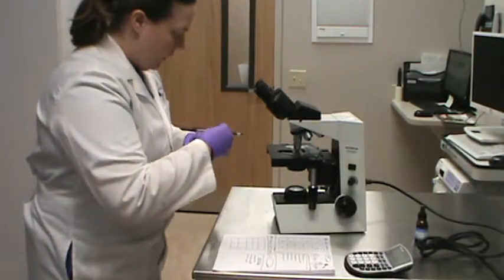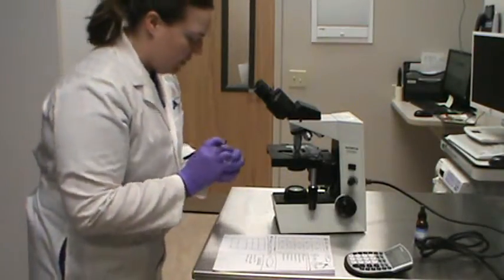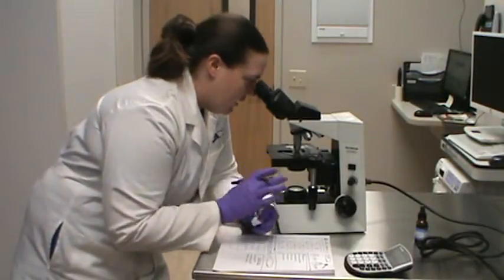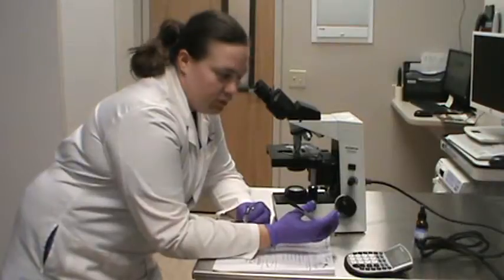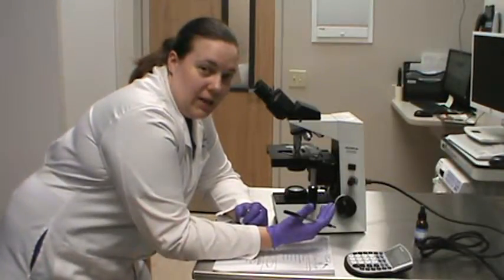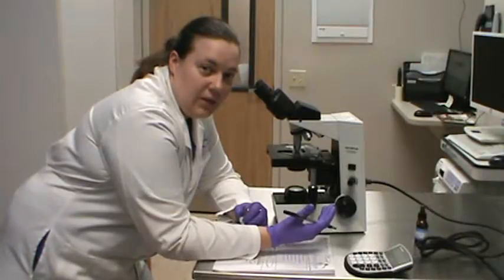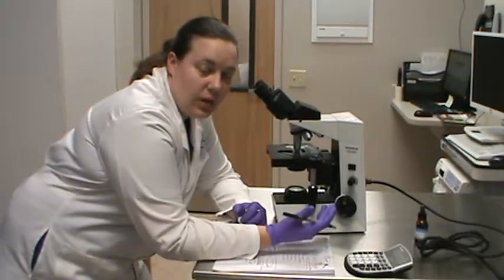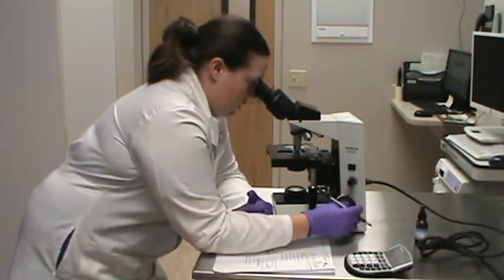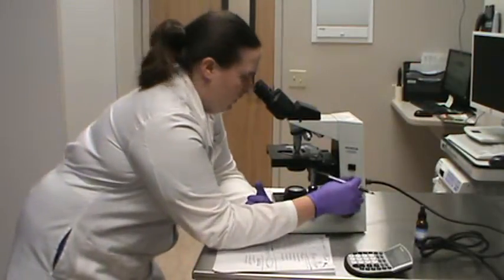Okay, so we're going to go ahead and count our white blood cells. While we're looking at our slide, we have to keep an open mind for any abnormalities or morphologies that we might see, because we're going to want to note that down at the end as well. I'm just going to turn the light up a little bit.